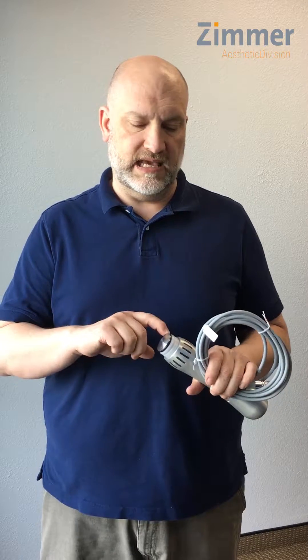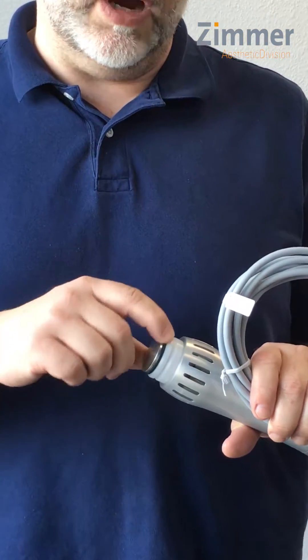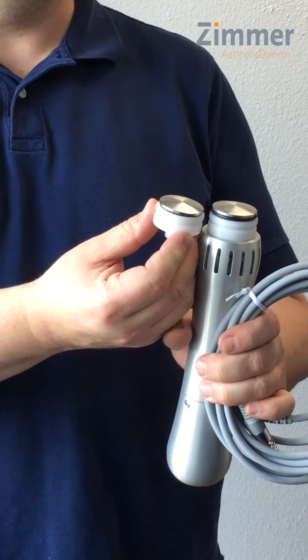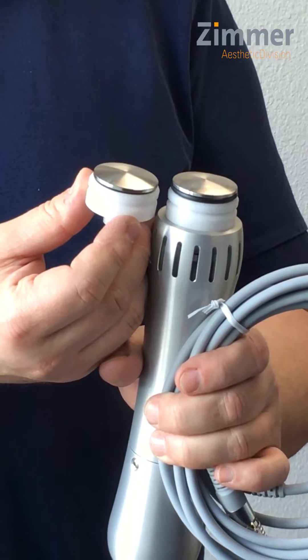When changing an applicator for a Z-Wave Pro, the applicator tip will usually need to be changed between 250 and 300,000 shocks. What you'll start to see is the blue or black rubber grommet underneath the metal disc will start to kind of poke out. This is a used applicator head, this is a new applicator head — you can see the difference. So when it starts to bulge out like that, it's time to replace it.